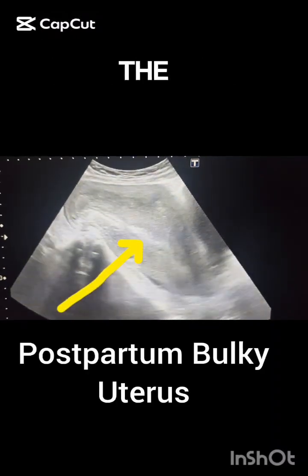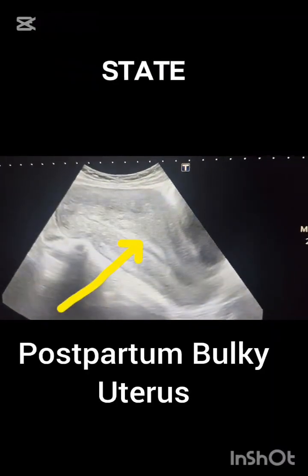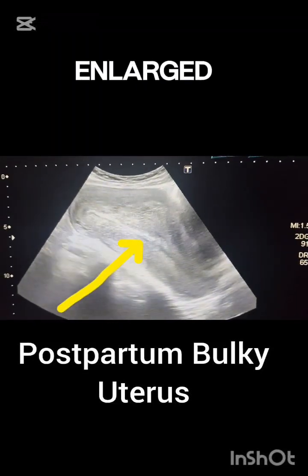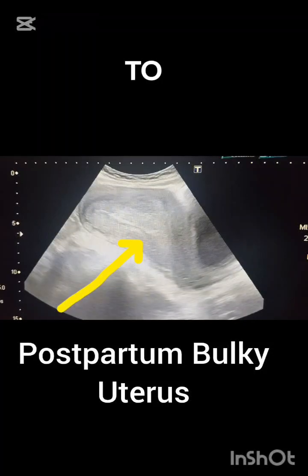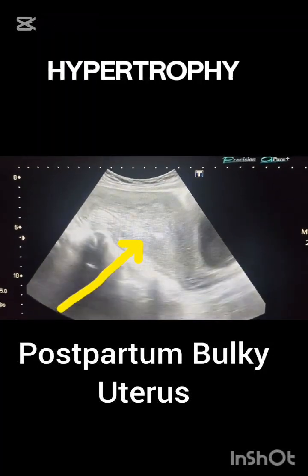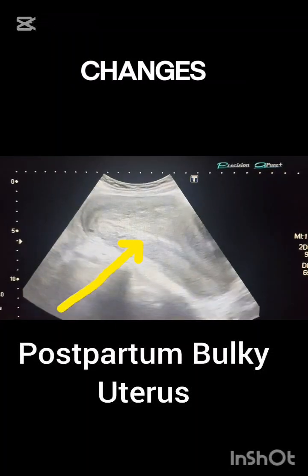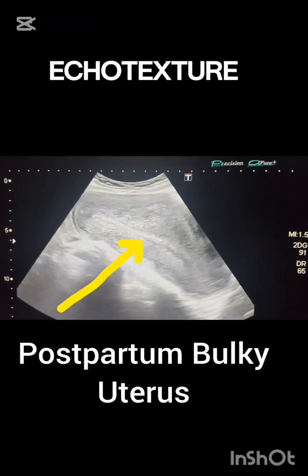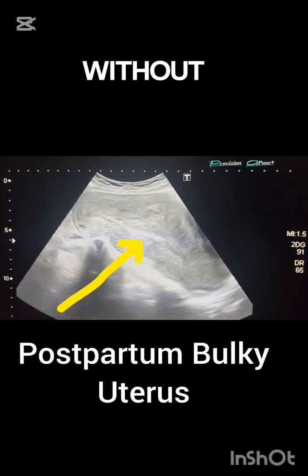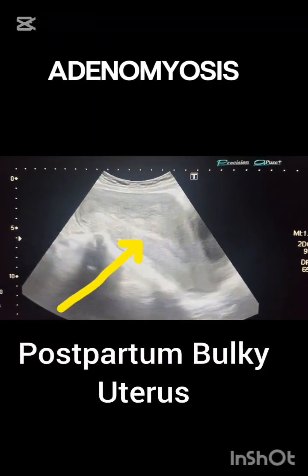Ultrasound examination of the pelvis reveals a bulky uterus consistent with the postpartum state. The uterus is enlarged in size, which is a normal finding following delivery due to residual myometrial hypertrophy, increased vascularity, and involutional changes. The uterine outline appears smooth, and the myometrial echo texture is homogeneous without evidence of focal lesions such as fibroids or adenomyosis.